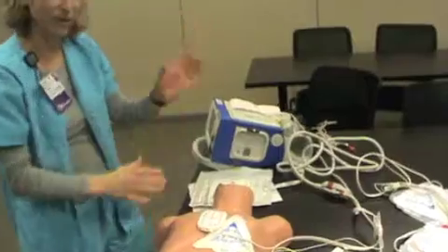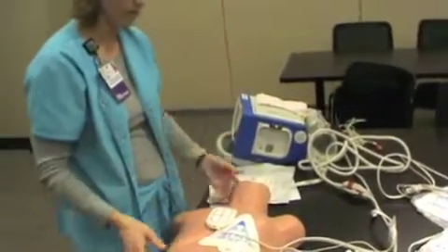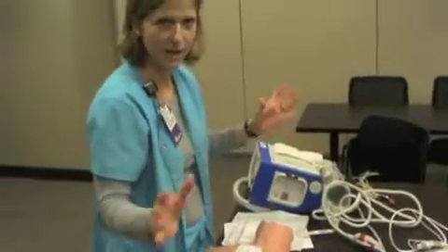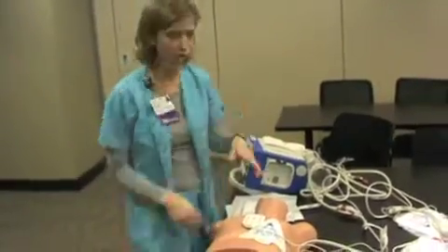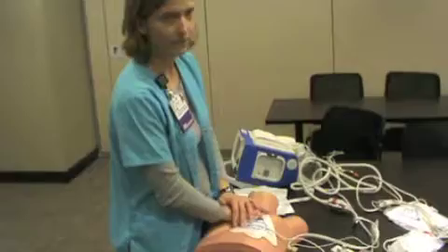I was going into my patient's room and, good morning, I'm just giving you your meds, and then all of a sudden his eyes roll back and he goes unresponsive. Are you okay? Are you okay? Help, somebody call a code. And I start chest compressions while I wait for the defib to come.